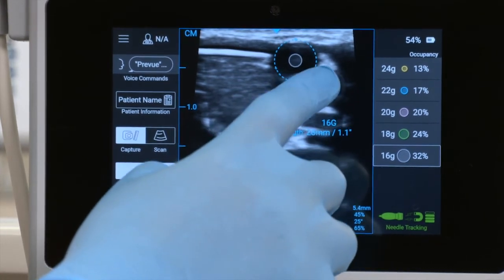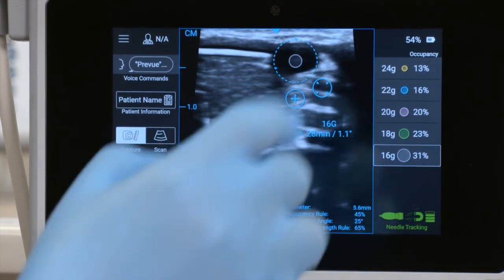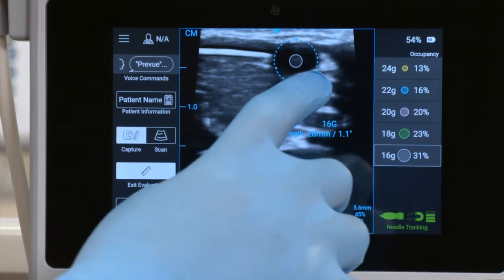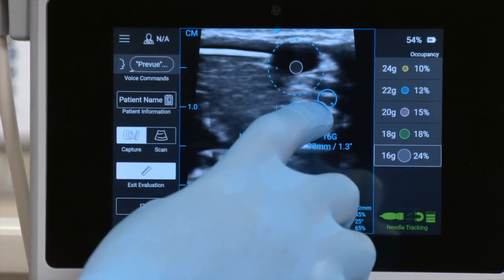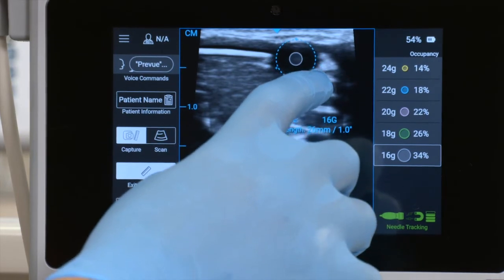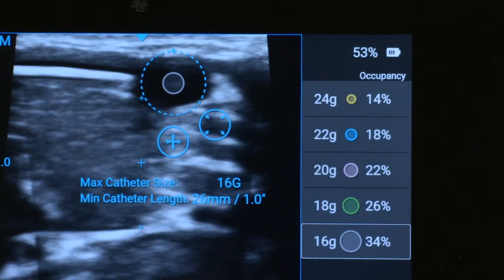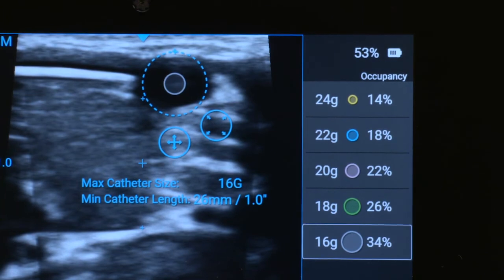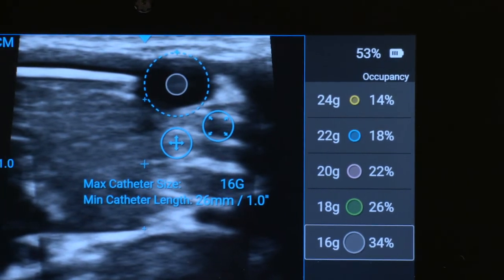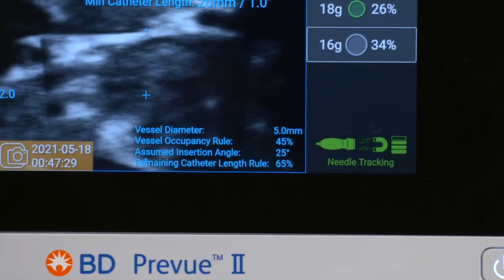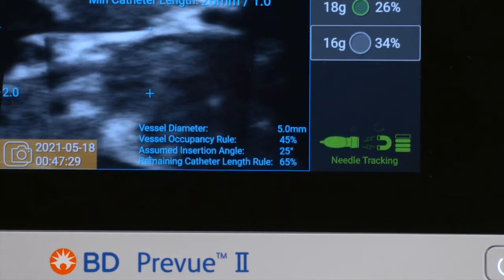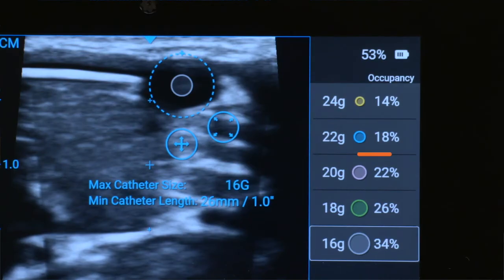The tool can be both moved and resized. Align the top center of the tool with the top center of the vessel, and then resize the tool. The screen displays both the maximum catheter size and minimum catheter length that comply with the rules that were set. Vessel diameter is also shown below, along with the vessel occupancy for various catheters.